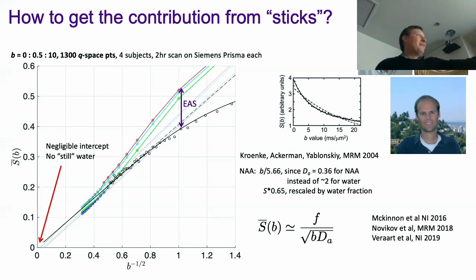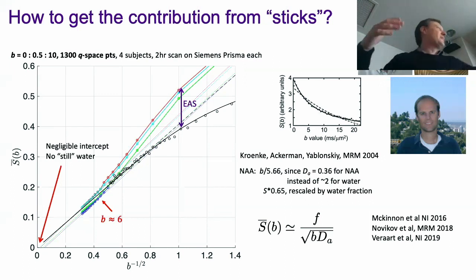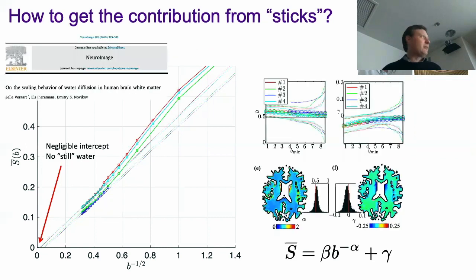And so now, obviously, this is the extra-axonal contribution. You can right away read off where it disappears. At b = 6000 or 7000 roughly, there is no extra-axonal contribution. All the scaling you see is from intra-axonal space only, based on non-trivial non-analytic scaling. Okay, so can we go?